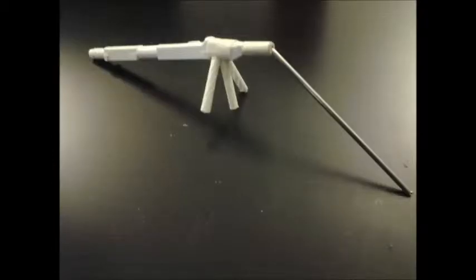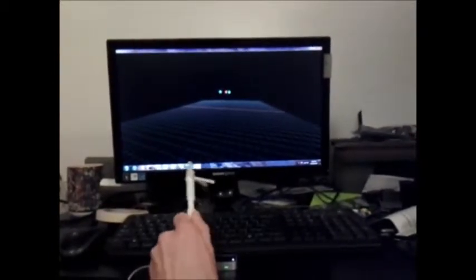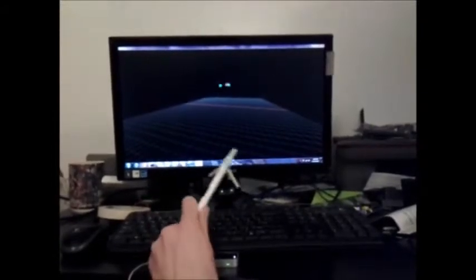This method of tracking involves 3 attachments to the tool. The end of the middle attachment, in red, is found by finding the minimum angle between the 3 attachments using their direction vectors. Once the middle can be found, the left and right attachments can be differentiated from one another, and the tip of the tool can be predicted.